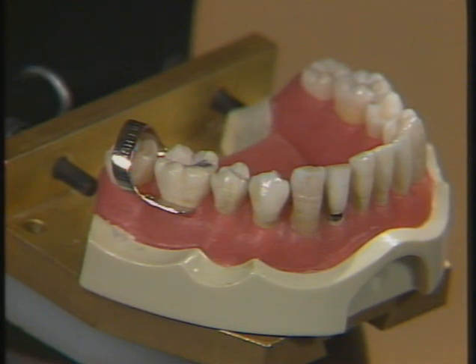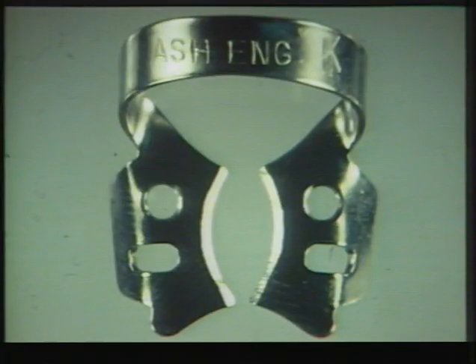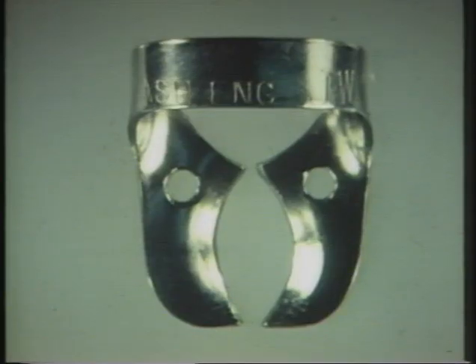A flat-jawed clamp, which is more satisfactory for gingival retraction, though fine here as shown, may be less stable on a tooth that is not well erupted. Whereas some clamps have wings, wingless clamps are usually easier to use as they allow much better access for using dental tape and for placing and wedging matrix bands, etc.